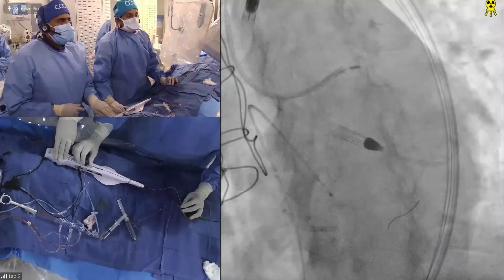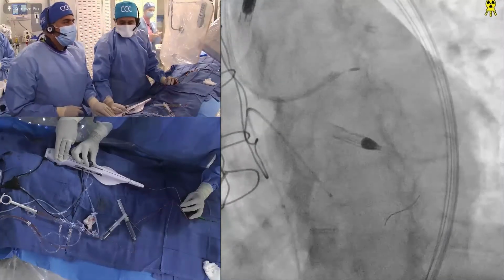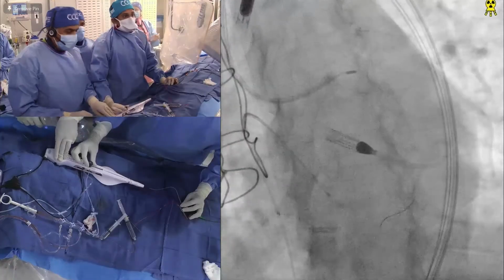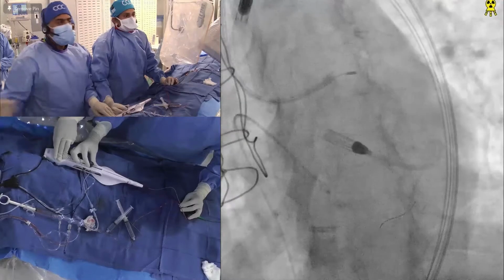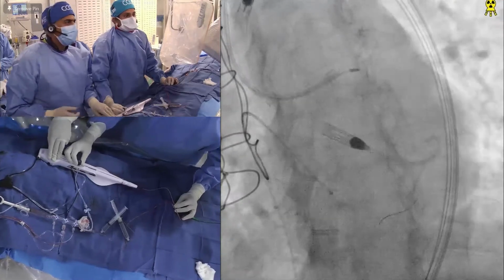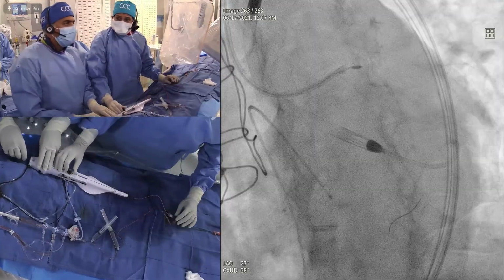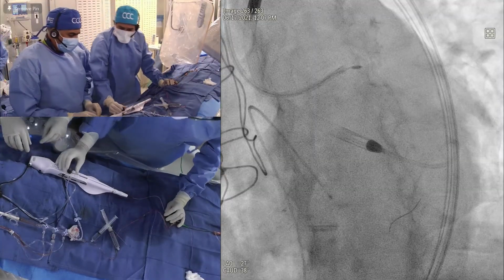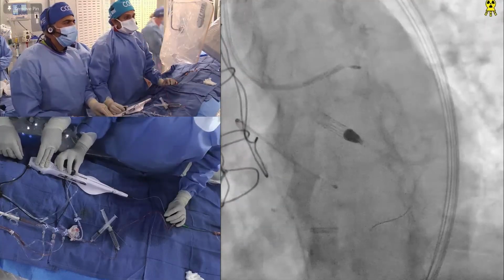And you know that one of the reasons for Impella here is also that there is a very high chance of perforation in this case. Very high chance. So at least it will allow us to do a workhorse wire, gutter, and so forth. Speed it up a little bit. So that's why we said some people may feel Impella may be a little overkill, but it is just to make the procedure a little safer.